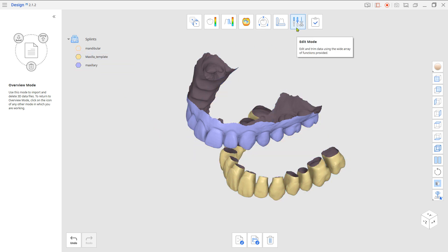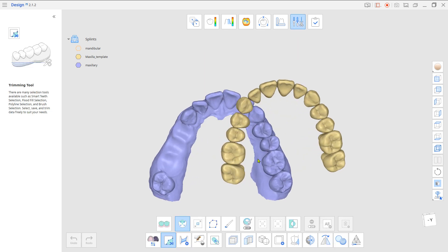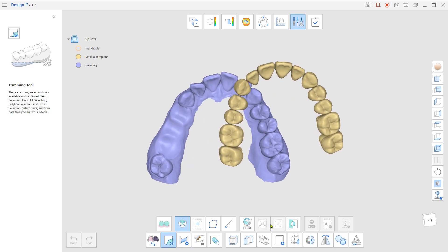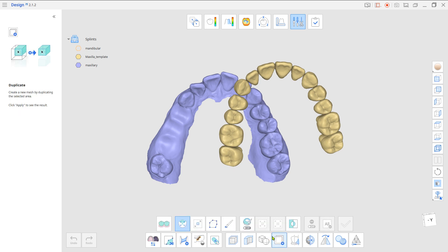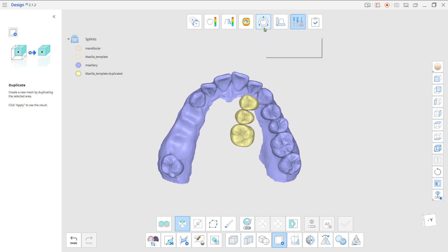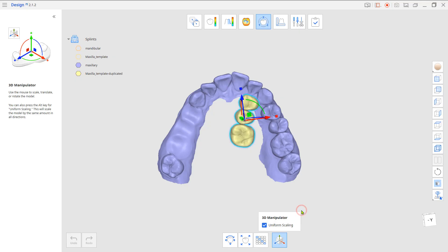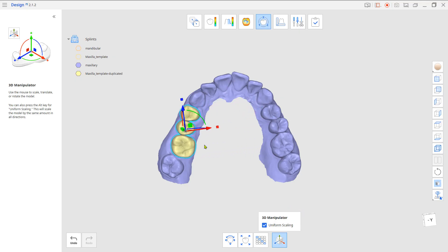Go to Edit Mode and duplicate the missing teeth from the template. Then go to Transformation Mode and place and scale the duplicated teeth to the missing spot.